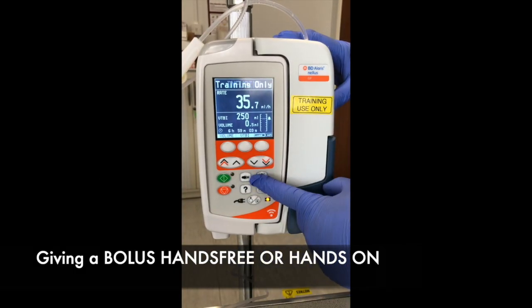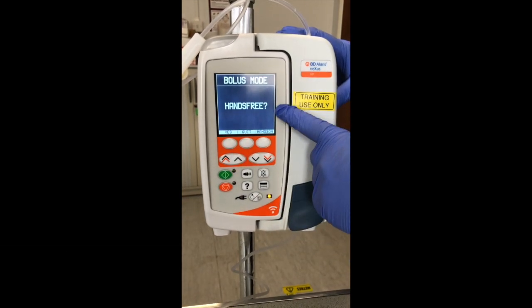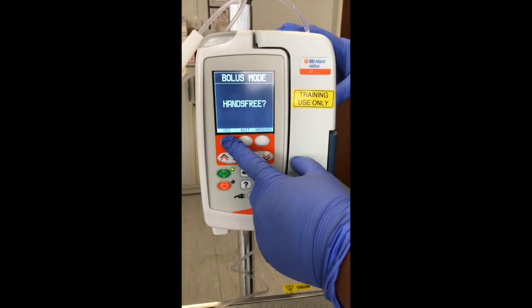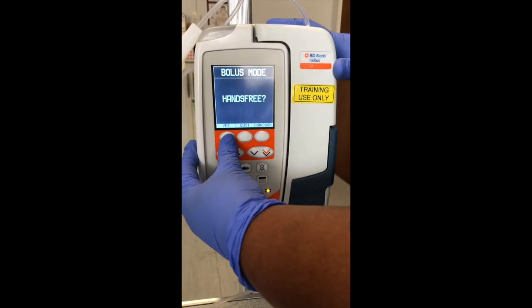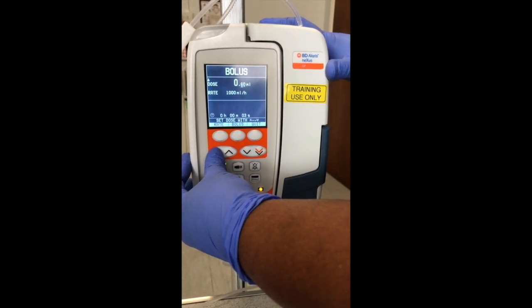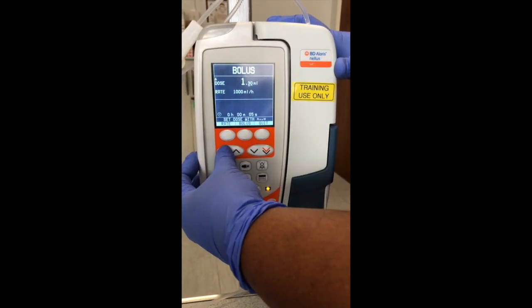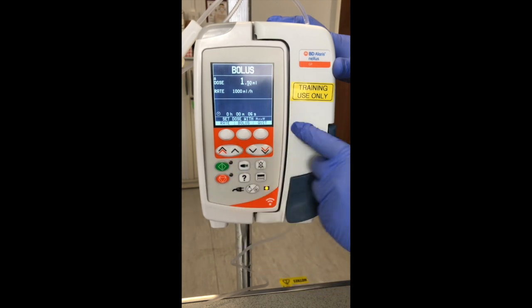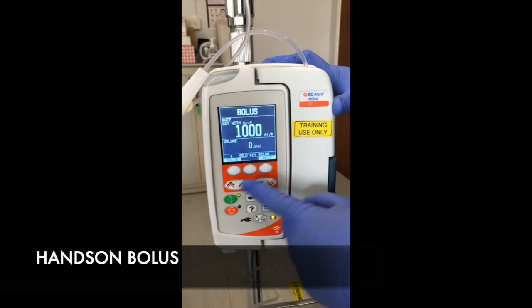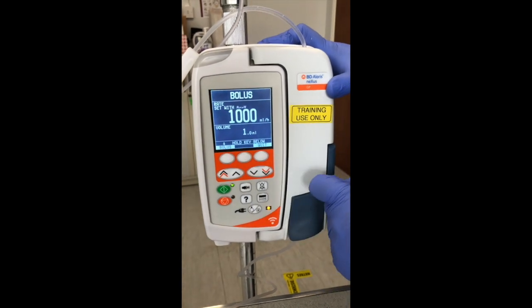Whilst the pump is running, press the syringe or the bolus button, and again it'll come up with bolus mode hands-free or hands-on. You can choose what method you want. It's the same as the CC pump. If you press yes, you will set your dose, again using your chevron keys to get the dose. And then once you're ready, bolus. If you want to give a hands-on, you press the hands-on and the bolus until you get your 1 ml.